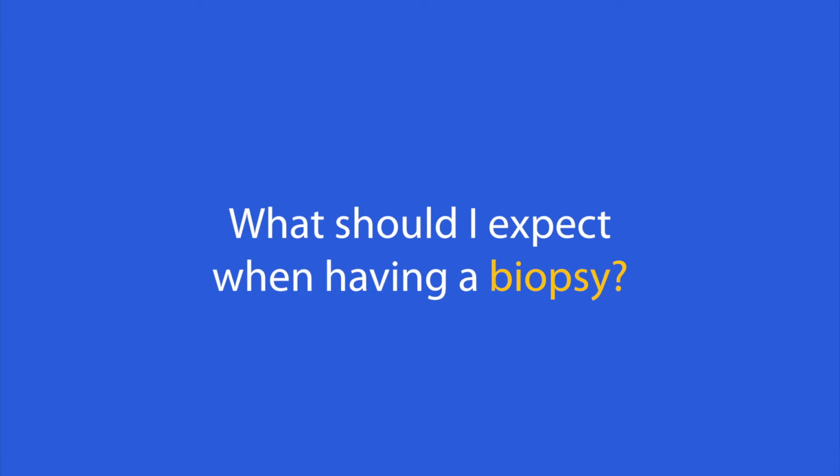The goal of a biopsy is to obtain a sample of the breast tissue, not the entire suspicious finding. If cancer is found in the biopsy, then surgery will be performed to remove the cancerous tissue from the breast.